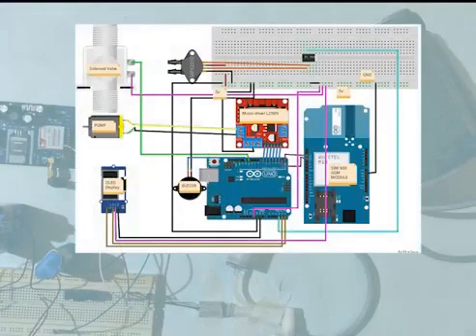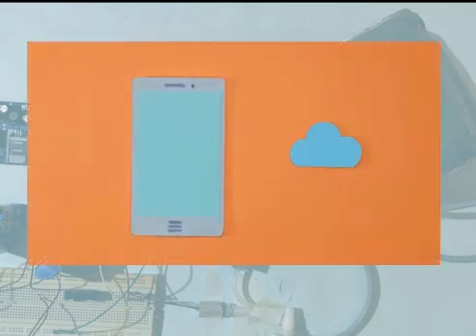Let's look into the hardware design, where we have tried to design a prototype. As you can see, our design has an Arduino microcontroller unit at its heart, which uses other peripherals for sensory movement to get the data for ambulatory blood pressure monitoring. Then this data is sent on the cloud server for further utilization.